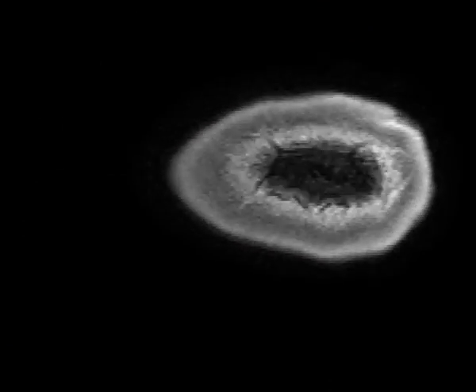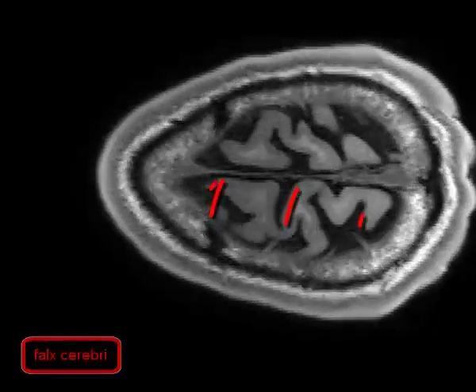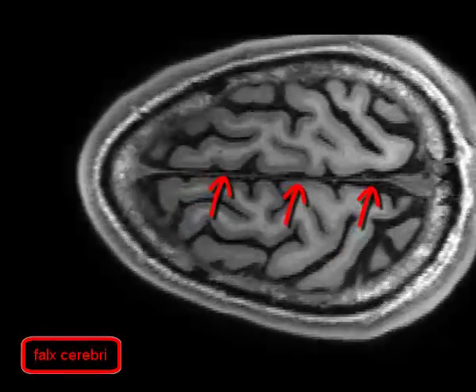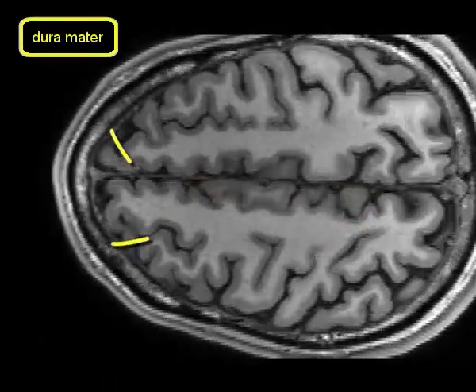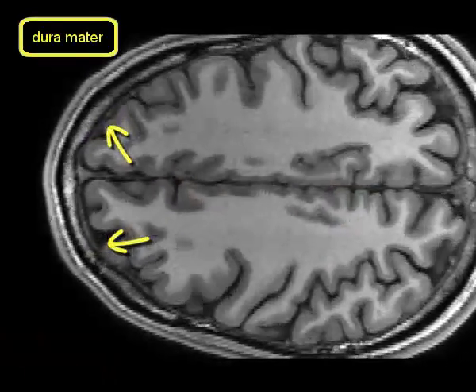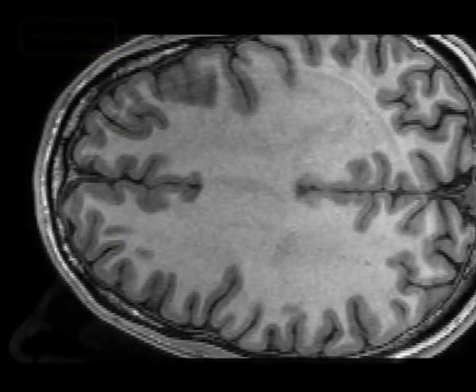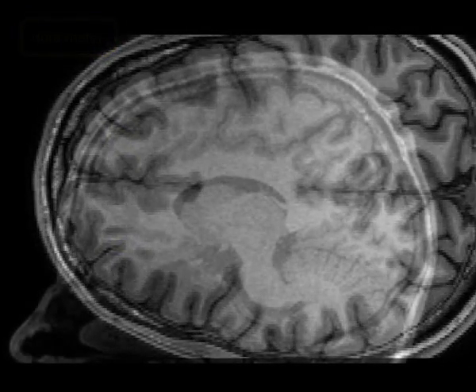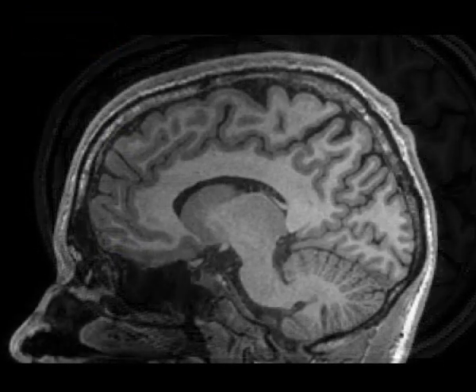In the horizontal MRI, the falx can be seen easily, while the dura is only a very thin line. In the sagittal MRI, the falx is only one pixel thick and it sweeps across the screen.